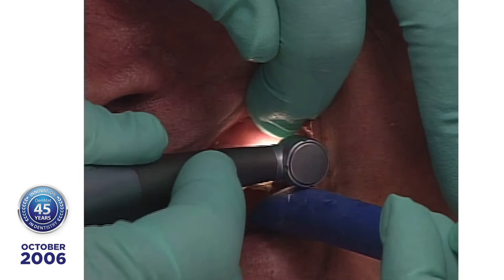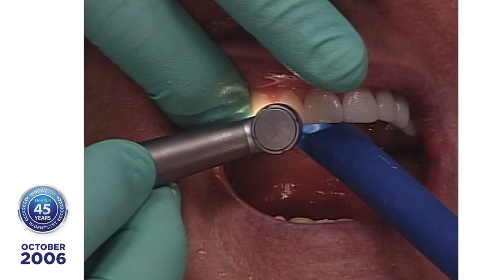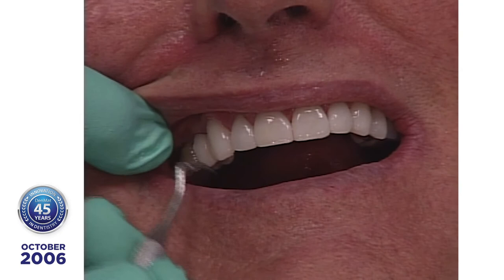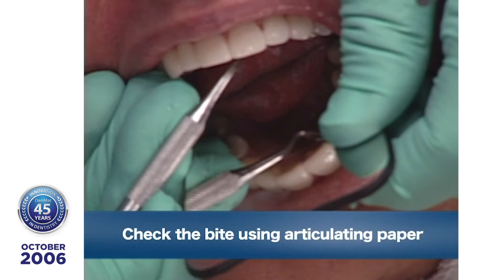Open wide. I'm going to shorten this lateral just a little bit. Okay. Now we're going to check the occlusion. Now close. So let's see what it looks like on the lingual side, because occlusion is critical. And if you don't have the right occlusion, harmonious occlusion, these things will chip and break.